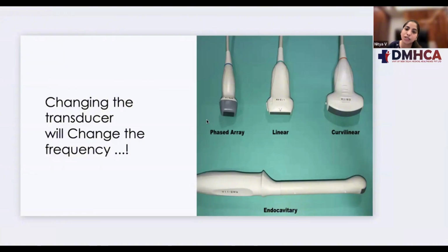It is used as a high penetration probe, and it is used in intercostal imaging and cardiac imaging. Then the linear probes, which are used for superficial scanning, such as bowel scanning, scanning of the thyroid, the superficial structures, and breast ultrasounds. Then the curvilinear probe, which is the most usable probe in ultrasound. That is used for abdominal scans, basically for the pelvis and the abdomen.